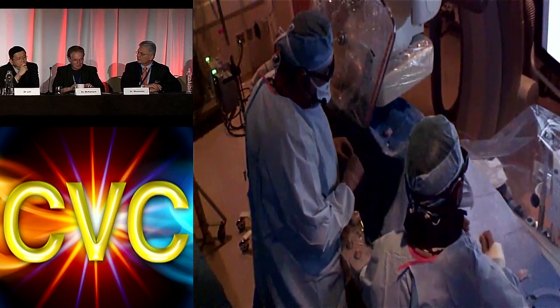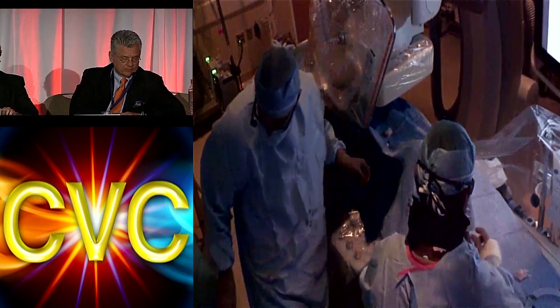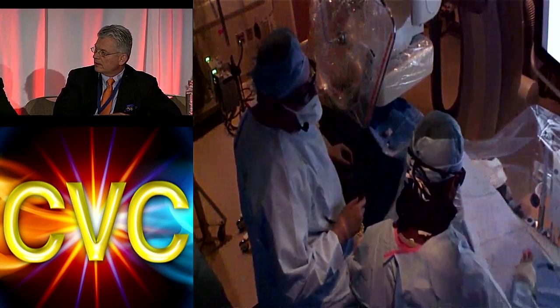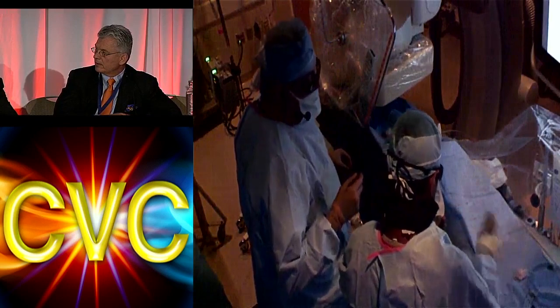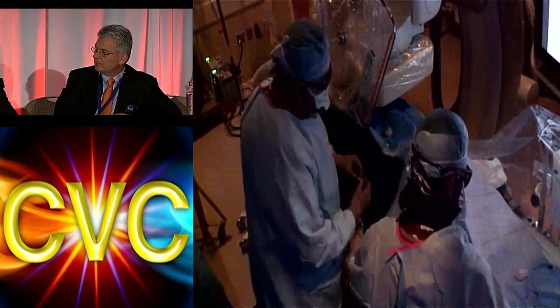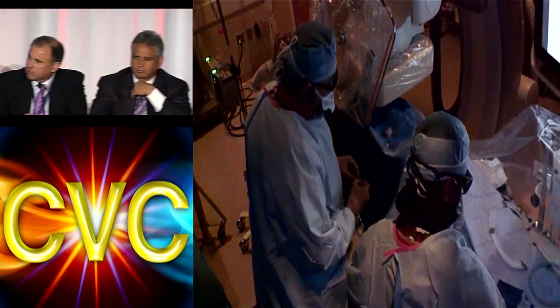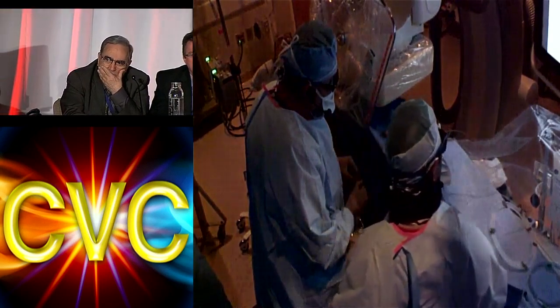Oh, right. In this case, I asked, would any of you on the panel consider using a 035 glide wire to wiggle through that occlusion? Yeah, I would try it, but it wouldn't be my first wire. It'd be my last shot that I would try from an antegrade approach. But I don't think there's anything wrong with using it as long as you do not extend a dissection.